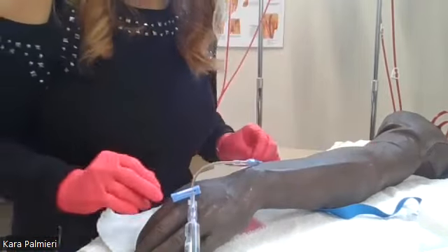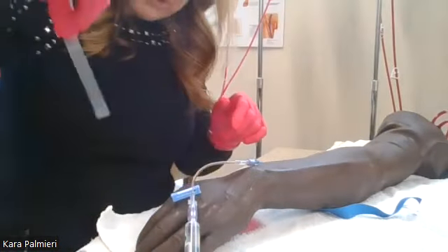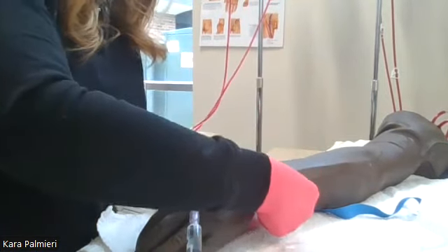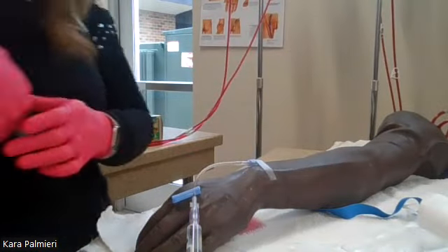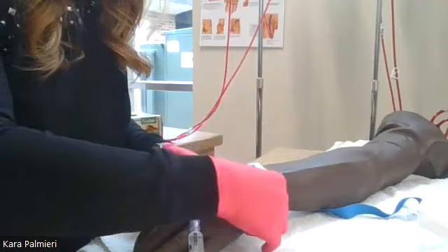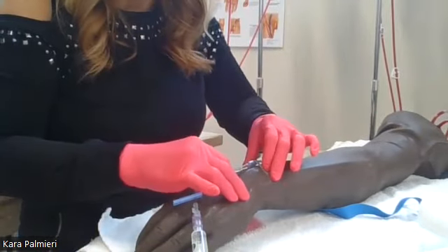Okay. I'm ready for some tape. So I'm going to take one of my little skinny tapes first, and I'm just going to anchor right across that blue. Okay. And then I'm going to put another one. Now, when you do this, wrap the tape around the tubing first and then put it to the patient so that you're not digging the tubing into the patient's skin. That would be really uncomfortable over time.